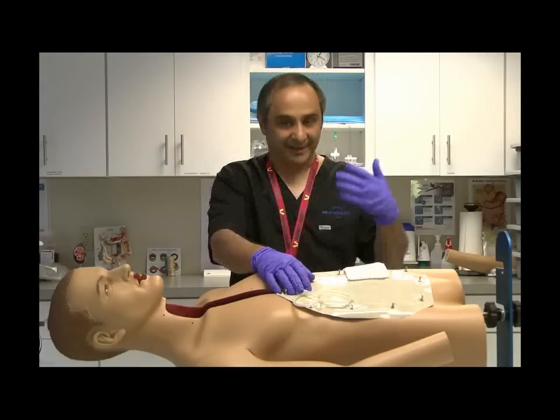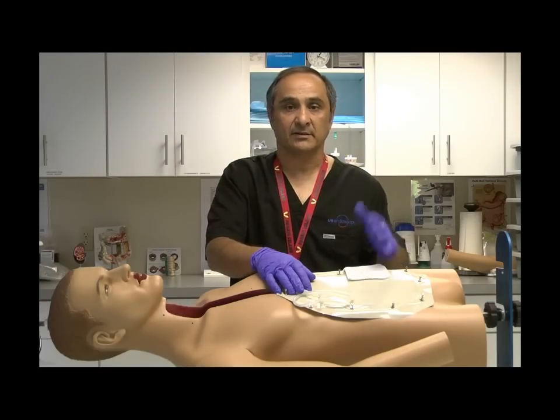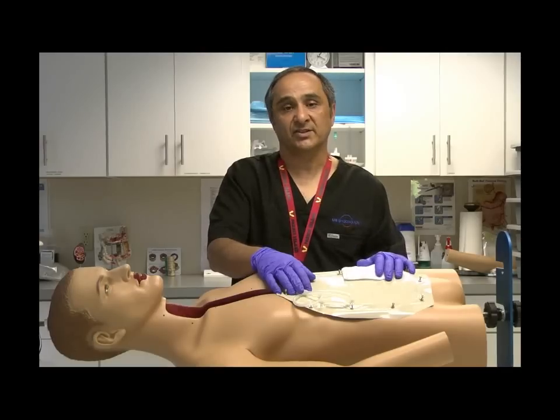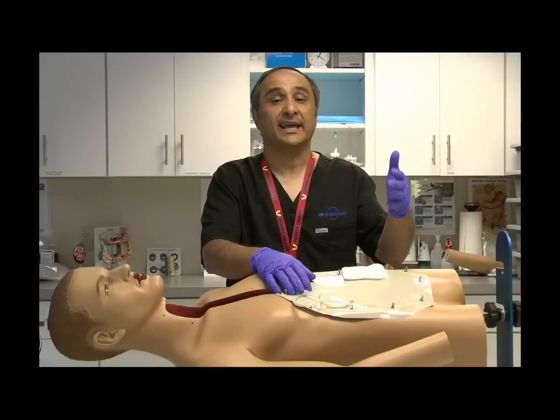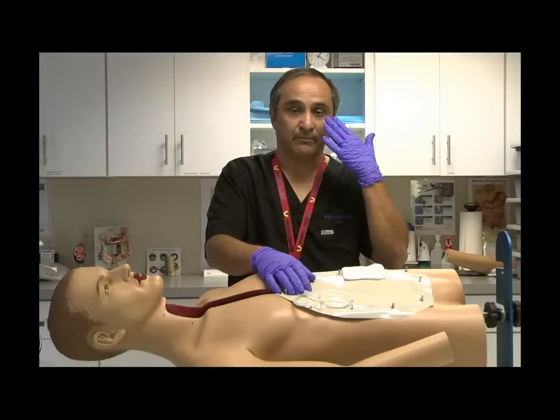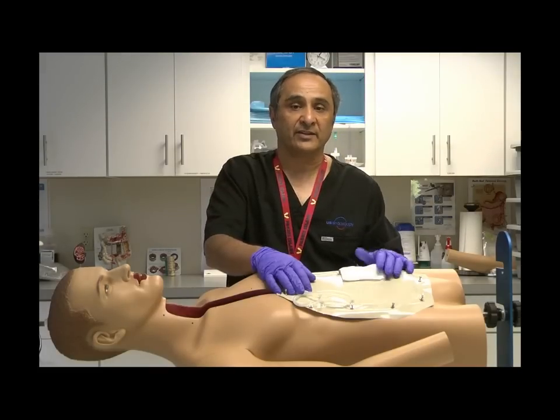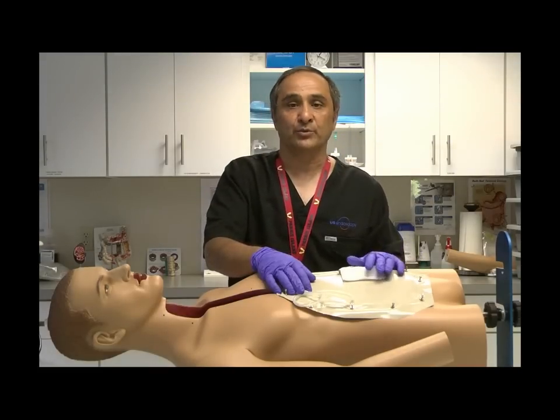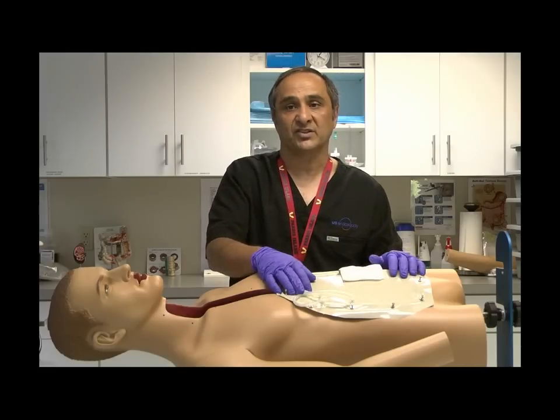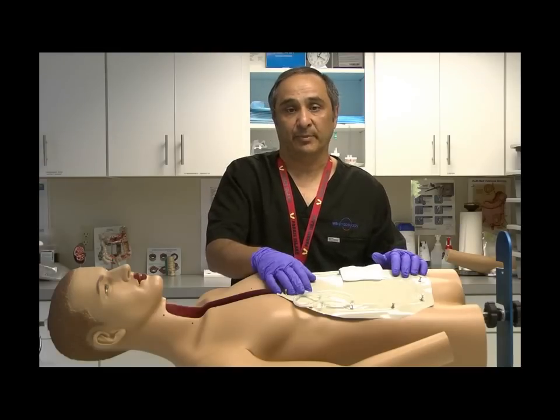Prior to removal, of course, make sure the operator has gloved hands, face shield if necessary, because there's an occasion where body fluids may fly out, go into the operator's eyes, and so on. Another word of advice for you, if you're in the room, do not stand immediately in front of the site when they pull it to protect you from any bodily fluids from the patient.